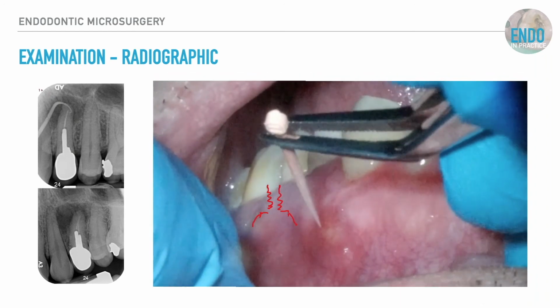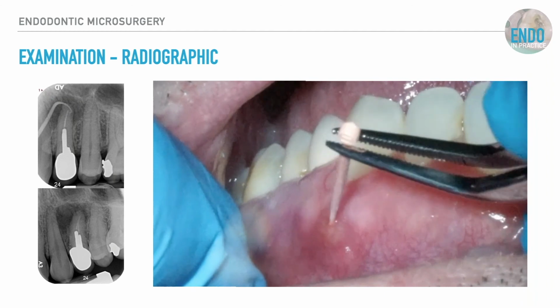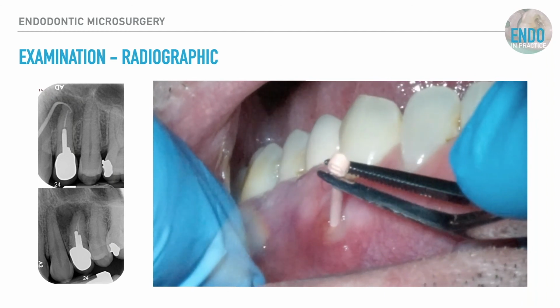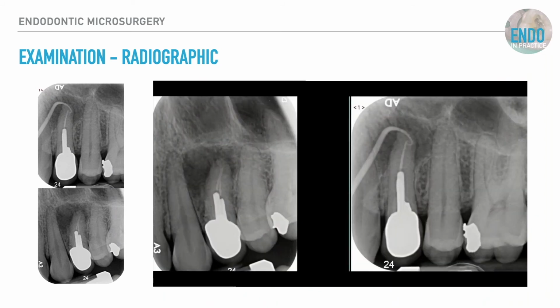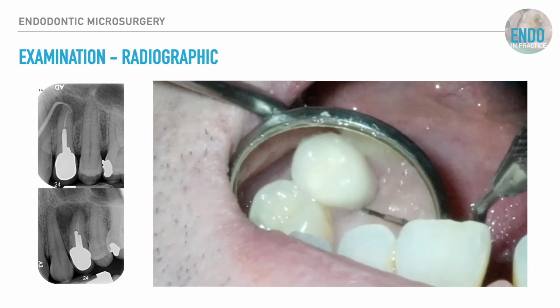The images on the left are from this patient because they were referred because the sinus was associated with, or the sinus was above, the canine. You can see how close it is to the canine. This is an accessory point. It's an accessory B point. An accessory A point is just too flimsy to pop in a sinus and trace where the sinus tract goes. You can see my PCP12 probe.